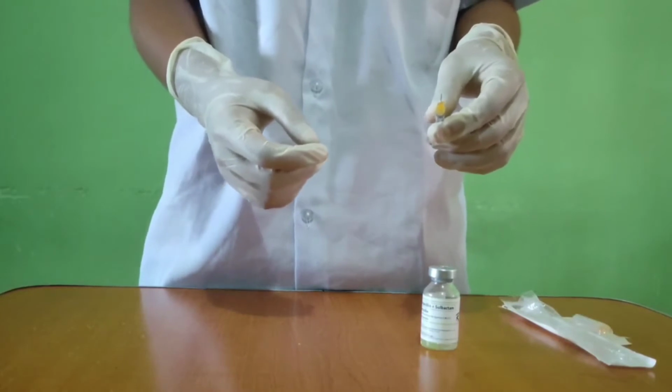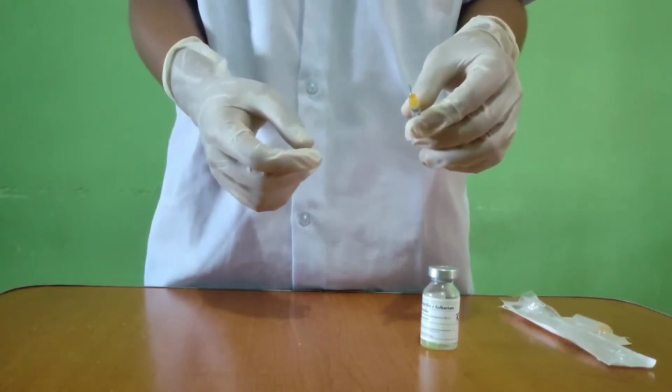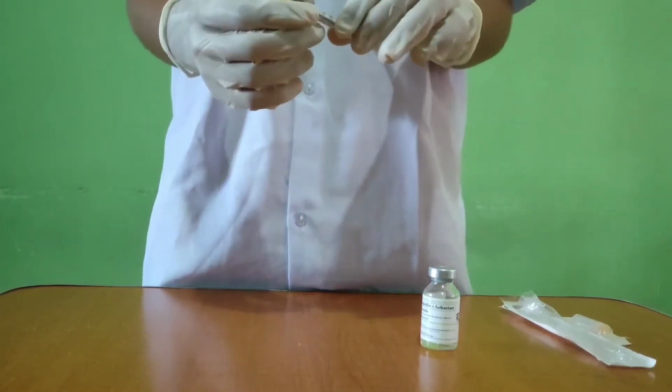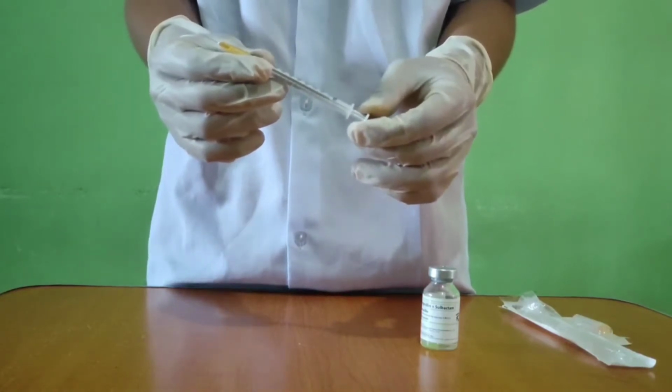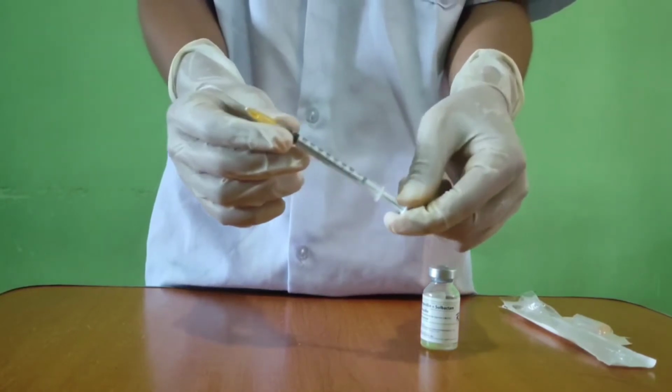Let's assume the doctor's order is 0.3 cc. So we pull back the syringe until it reaches 0.3.